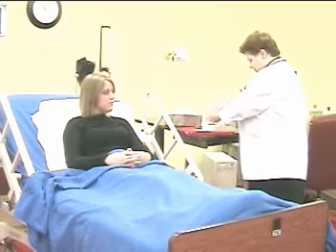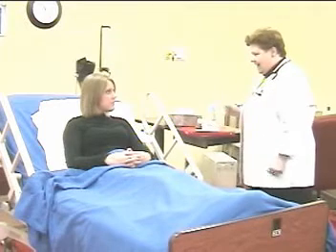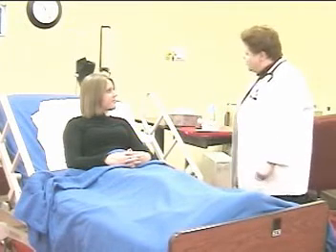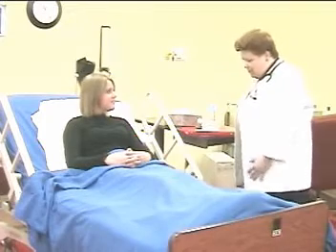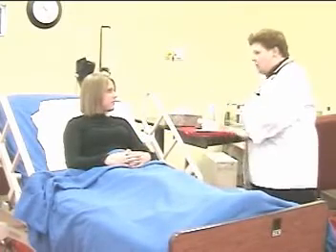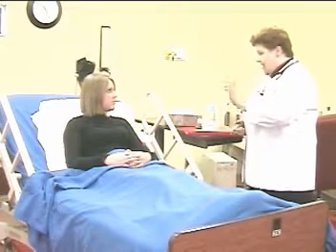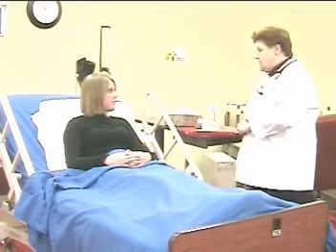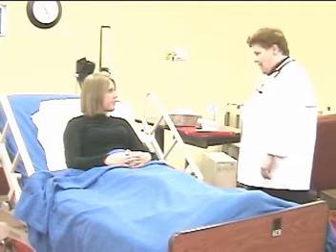Gives thorough and complete instruction and identifies the patient. Hi Michelle, my name is Brendan. I'm from the Respiratory Care Department. How are you today? Before we get started, can I please check your name band? Thank you. I'm here to teach you how to use some medications that come in the form of an inhaler. The purpose is to help open up your lungs so that you can breathe just a little bit easier.